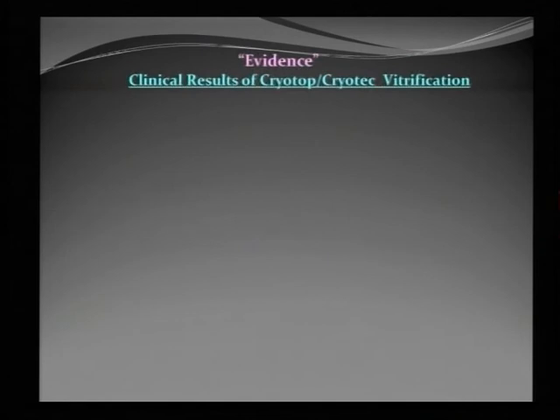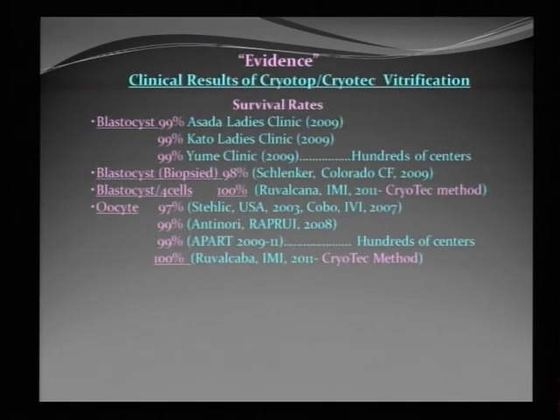So there is evidence. Cryopreservation, vitrification, is a technology for clinical use, so it should be reliable and universal. So we have many evidence.